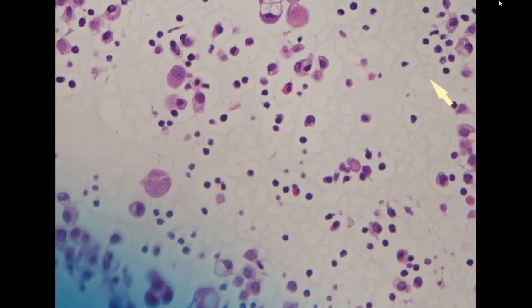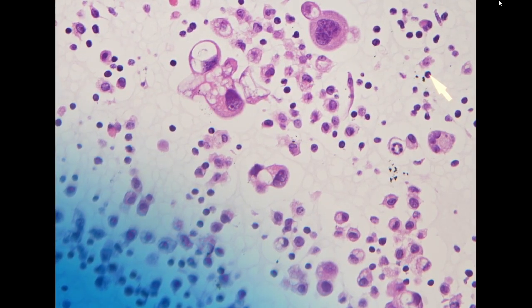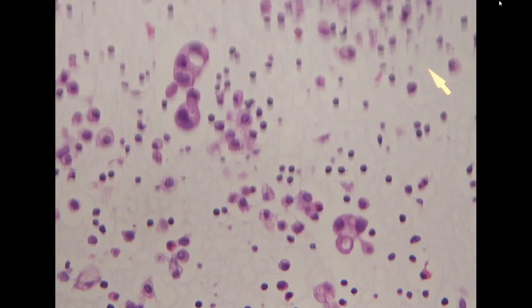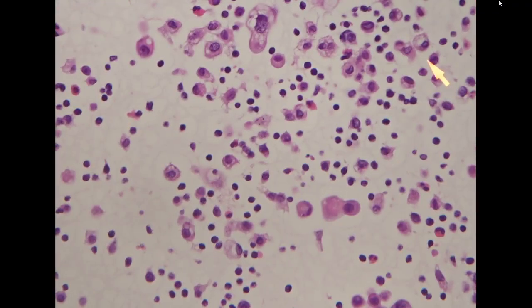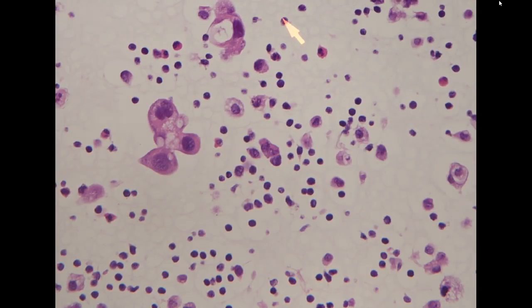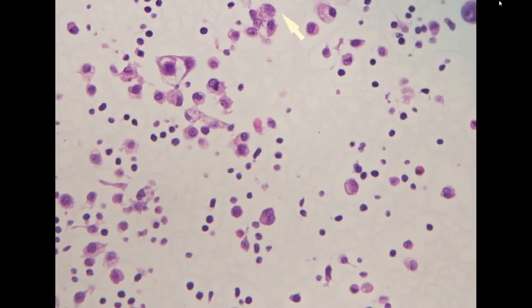So we really need to evaluate whether these are truly metastatic non-small cell carcinoma, or just highly reactive mesothelial cells. So we would do TTF1, we would do MOC31 as an epithelial marker, and we would do a mesothelial marker as well. So we would check what is happening with these atypical cells, because it is very unusual to have small cell transdifferentiated into non-small cell.